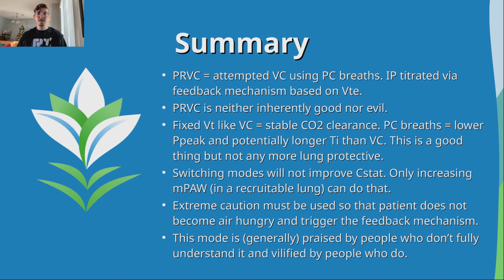In PRVC, the ventilator is going to have to calculate, oh man, I didn't get the volume I need. I have to titrate the pressure up, right? The vent has to adapt the pressure, and people market that as if it's some kind of benefit, that it's adapting the pressure. Well, volume control is adapting the pressure too, but it's doing it automatically based on the patient's lung mechanics. Like, yeah, it's adapting the pressure too, because the driving pressure is going to be determined by the static compliance. Like, what are we talking about, right?